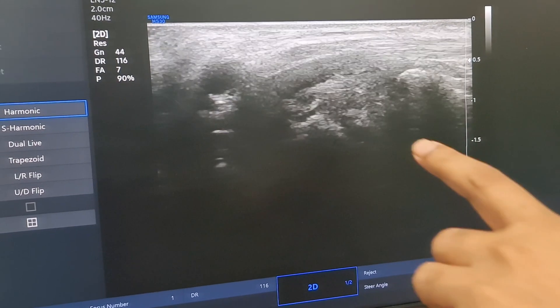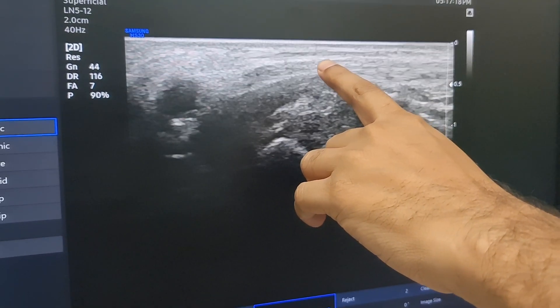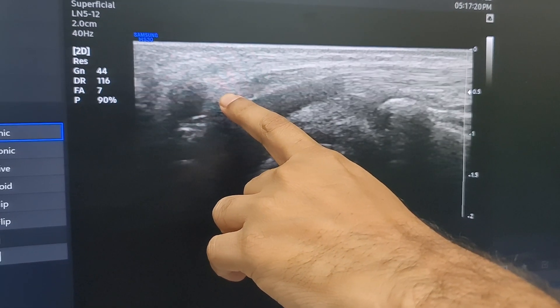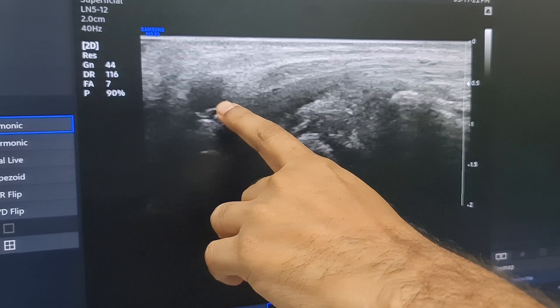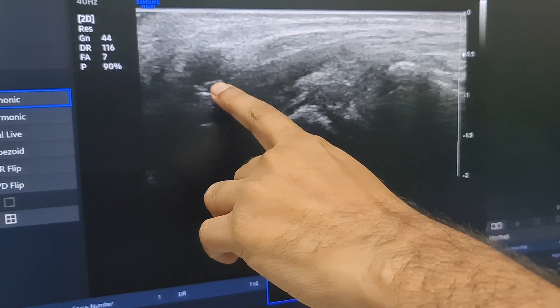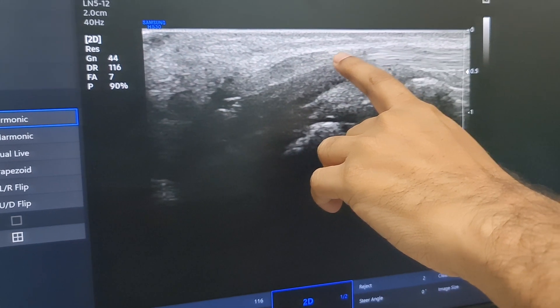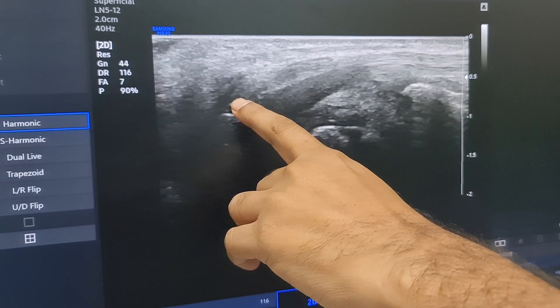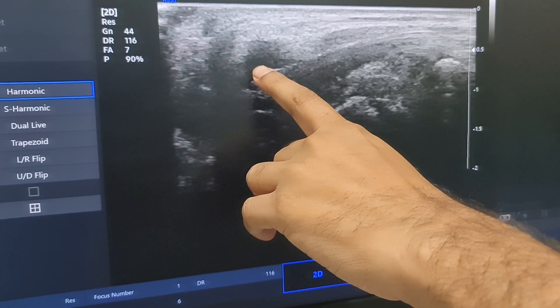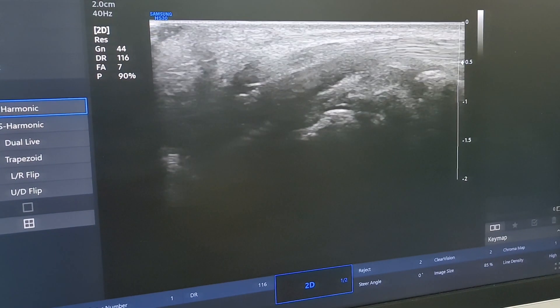This is the nerve and the cystic structure near the nerve in the wrist. This is the nerve and this is the cystic structure — that is called a ganglionic cyst — very near to the median nerve.